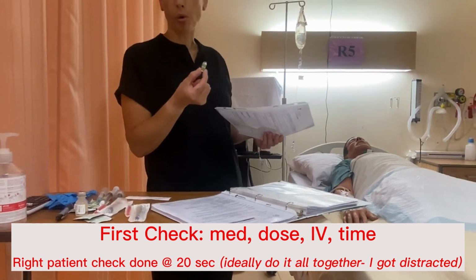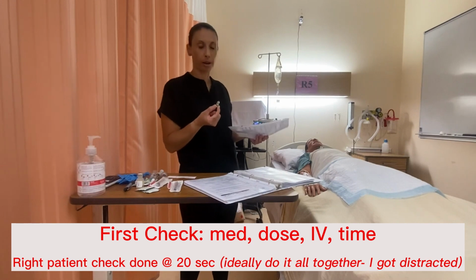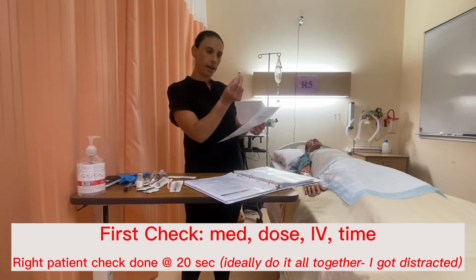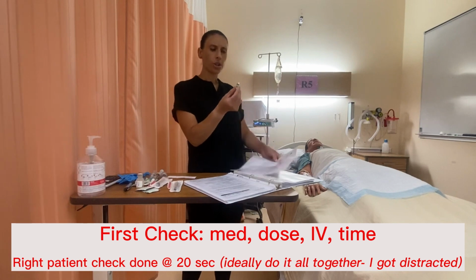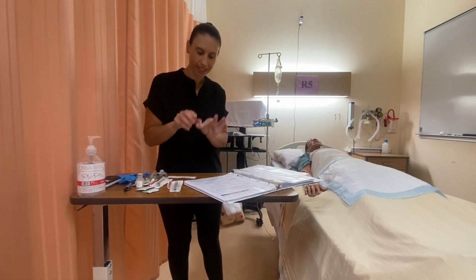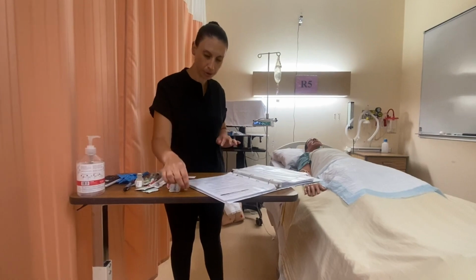Maybe I'd have to get more than one vial if the dosage is higher, say 20 milligrams or 15 milligrams. So I would make sure I grab another vial if I needed it at that time. And I can see that this is IV, and it is due now. Other things you can check too is make sure the medication is not expired, and as well that it looks clear, okay, and it's not cracked already. And because we're in the lab, these have already been cracked, okay, and this is a glass ampule.